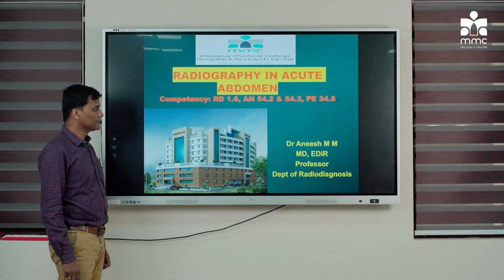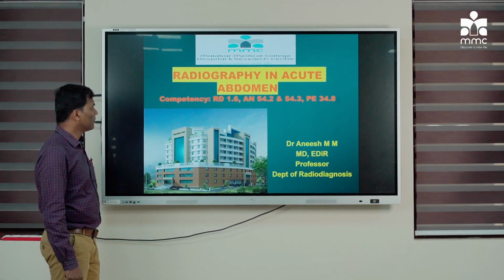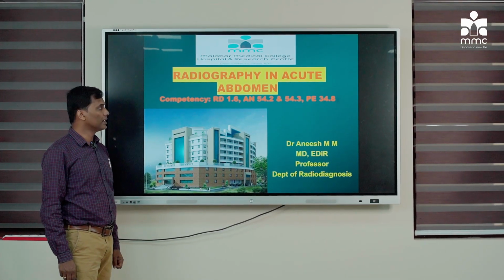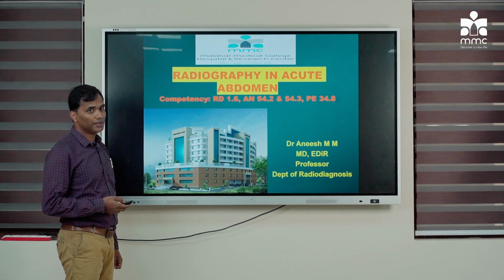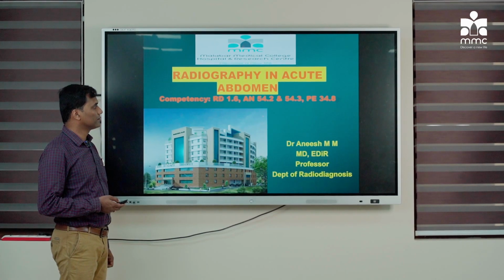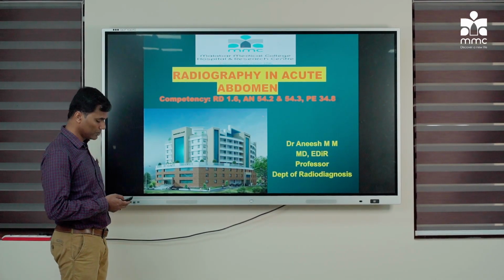Myself, Dr. Anish, Professor of Department of Radiodiagnosis. My topic for today is radiography in acute abdomen. So, I'll be mainly dealing with radiography, X-ray, and briefly touching on other imaging modalities like ultrasound, CT and MRI also.